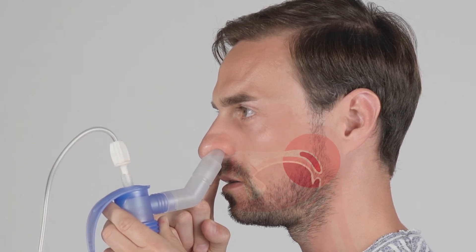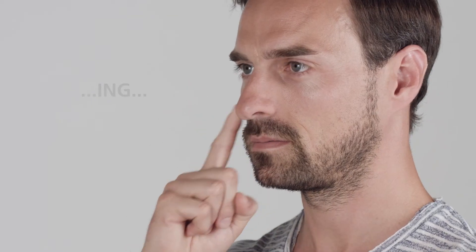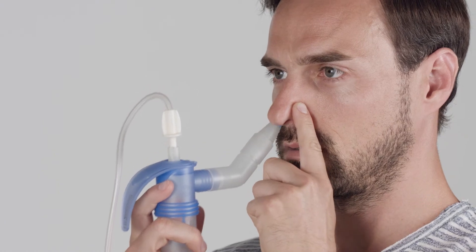One way of closing the soft palate is to repeatedly say "ing" for as long as possible. After completing half the treatment — two to three minutes — change nostrils. You'll notice a change in tone at the end of the treatment time.